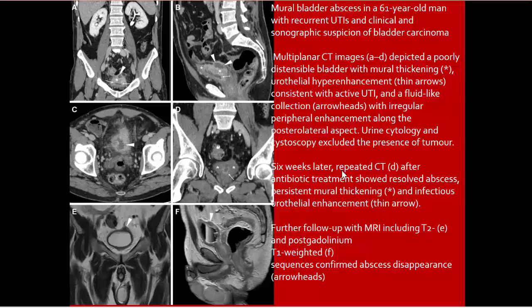Mural bladder abscess in an elderly man. Multi-phase bladder CT depicts a poorly distensible bladder with mural thickening, urothelial hyper-enhancement, consistent with active urinary tract infection. Fluid-like collection with irregular enhancement along the posterolateral aspect. Six weeks later, after antibiotic treatment, the abscess resolves with persistent mural thickening and infectious urothelial enhancement. Follow-up T2 MRI: abscess disappears completely.